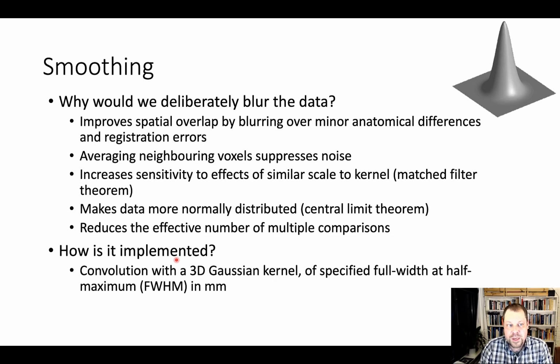So now we've done a lot of steps to ensure that we have the highest resolution data, the smallest pixel, and we pay a big price for this because it's a trade-off between the size of the pixels and the spatial resolution and the temporal resolution that we make when we make decisions about the sequence that we use. And then the final step here, we decided to blur the data.